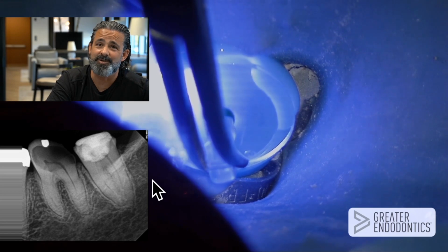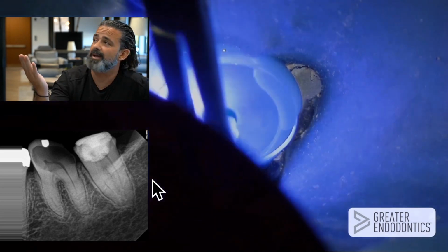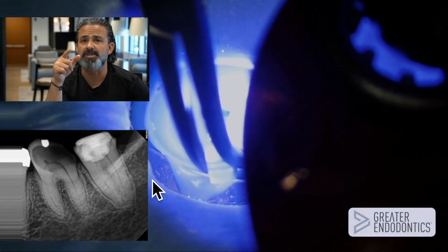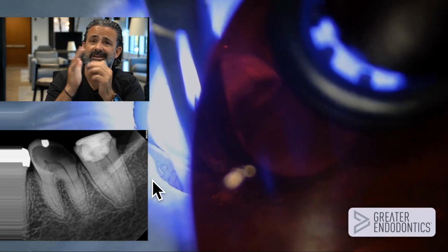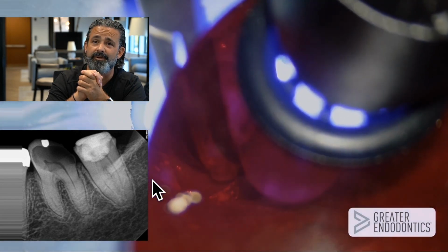I one time watched Reed Pullen put it towards the distal. I think he likes looking at the distal under a mirror, I guess. But I like the mesiobuccal line angle, and that is just really to help you dislodge it off of the platform after you cure it. The other thing, remember, folks, that these platforms are clear, so you can cure through it, and you're not going to touch it. So I actually like the heat of the light touching the matrix because it just cures better.